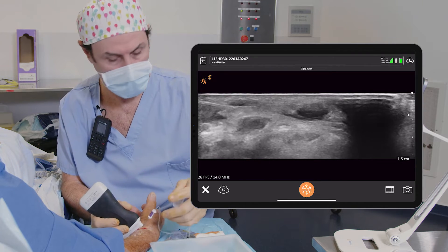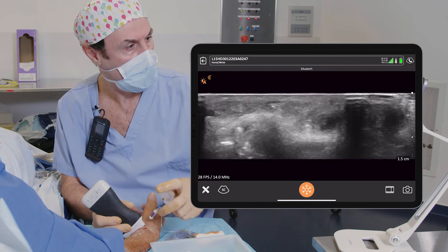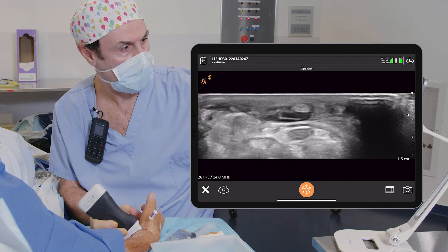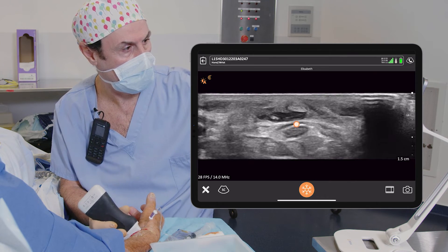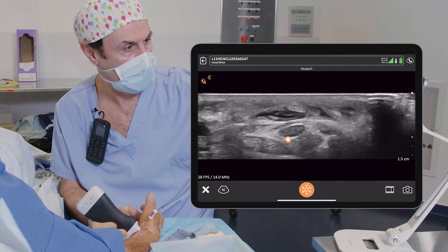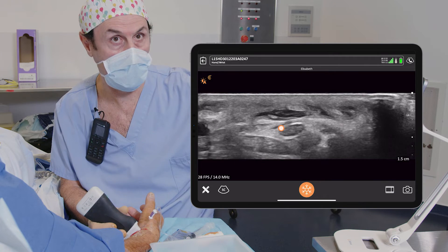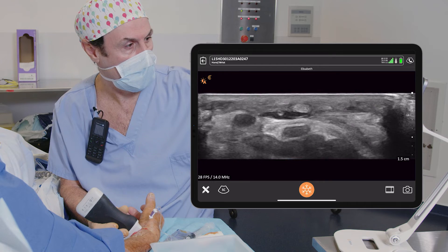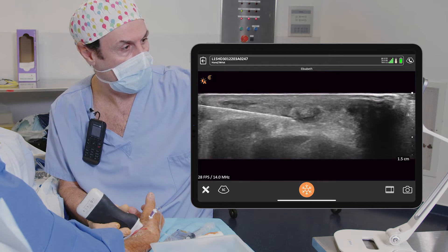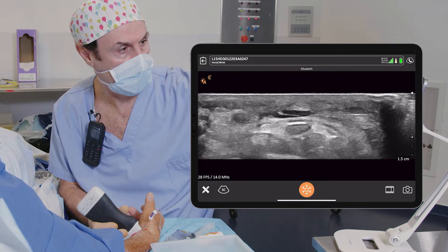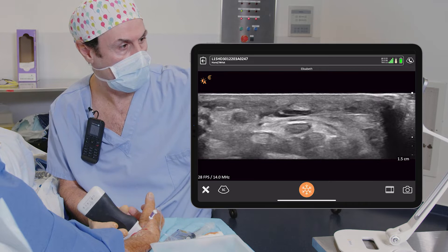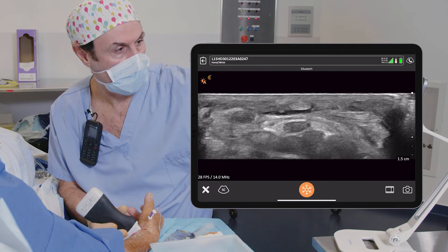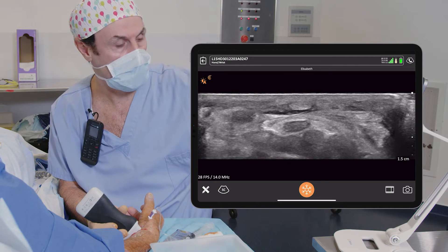I'm injecting in the subcutaneous structures just in front of the nerve, which is here. The median nerve is here. And we have infiltration of anesthesia in all five centimeters in front of the median nerve and the surgical site.